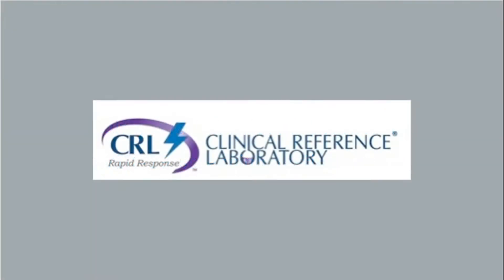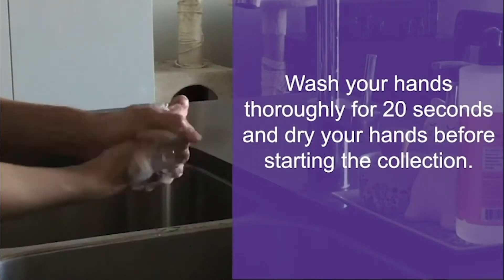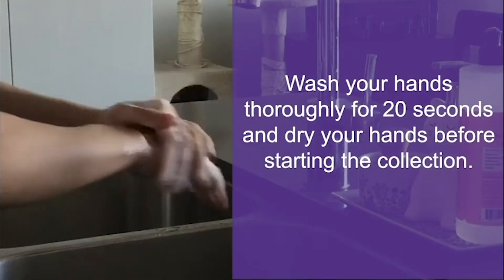You have received a kit for a saliva-based molecular test that is easily self-collected and shipped to our lab. This kit is authorized by the FDA under an Emergency Use Authorization. Results of the test confirm if the virus is detected in the saliva of the individual. It is important to wash your hands thoroughly for 20 seconds and dry your hands before starting the collection.